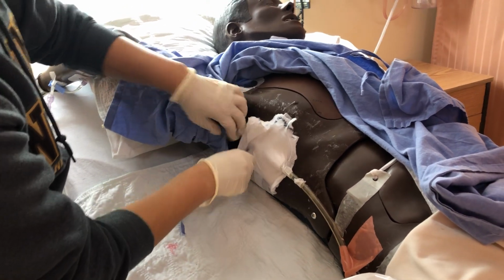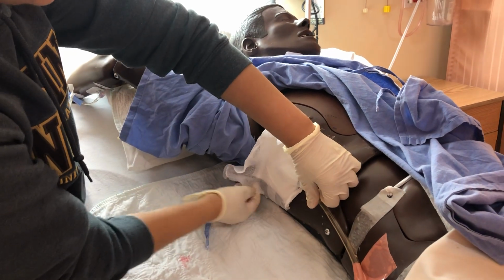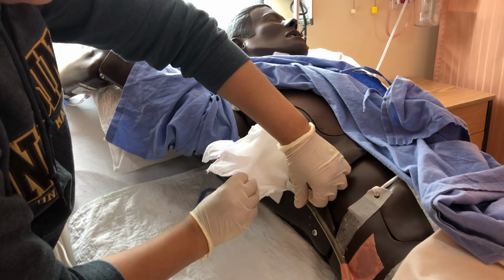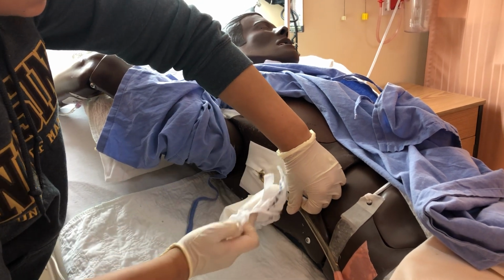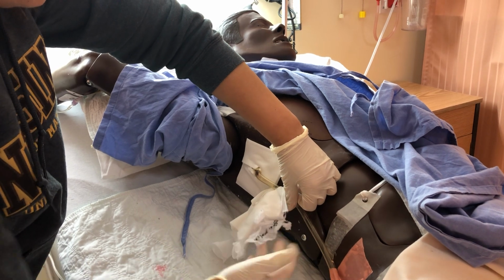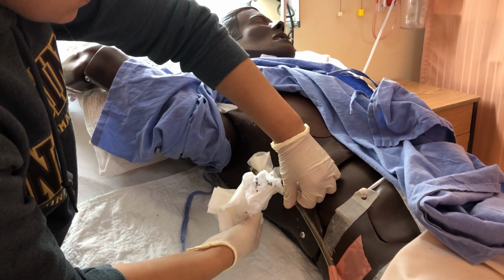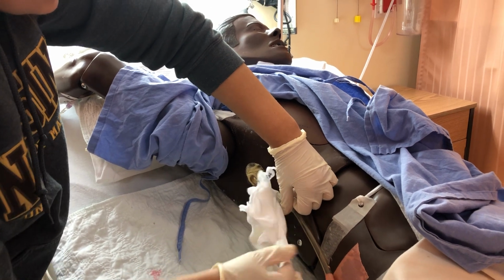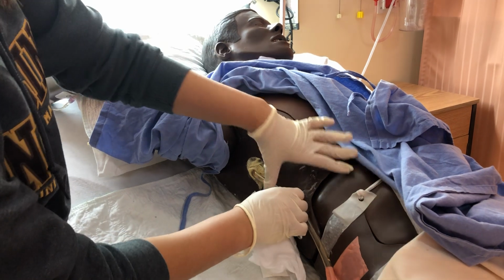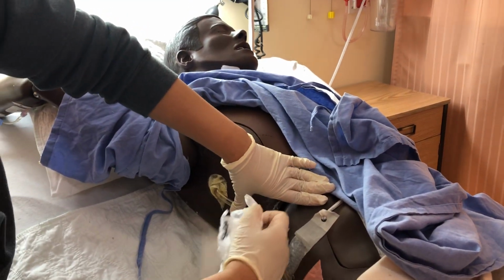Remove your pillow here. And then open up my. Right, I'm just gonna stabilize. Start with one. Sterile. We're just gonna do another one. One more swipe further away. So I started from size 7. And I'll be cleaning the tube, so it's fine if I touch it now.